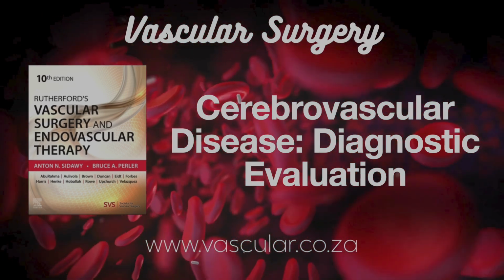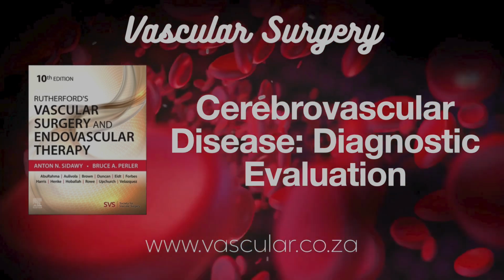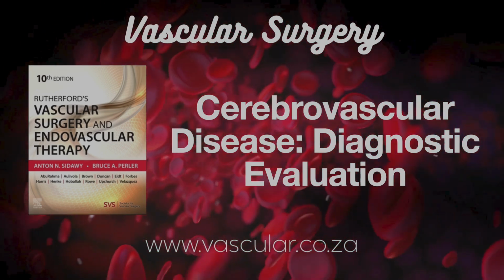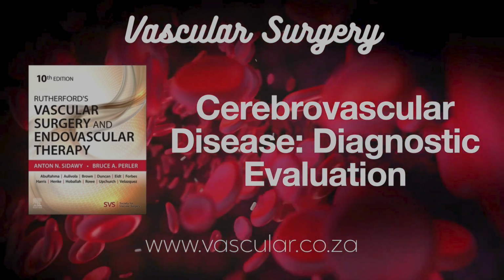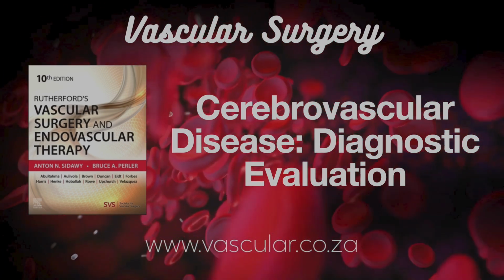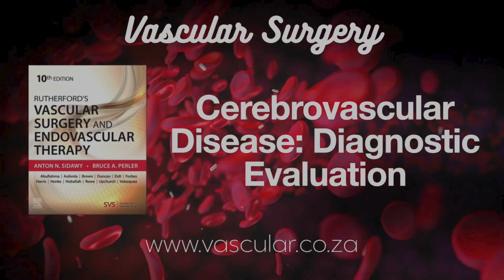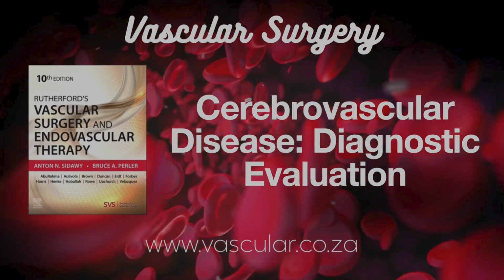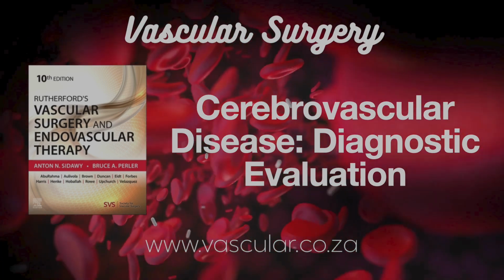That's good to hear. So when would a doctor typically order a CTA instead of just relying on the ultrasound? Often it's when the DU shows a borderline or moderate stenosis, maybe in that 50–69% range, especially in someone without symptoms. DU can be a bit less precise there. So for confirmation or better detail. Right, or if we need to see the arteries further up or further down, than the DU could reach well.